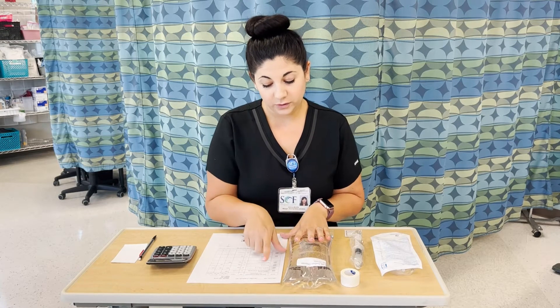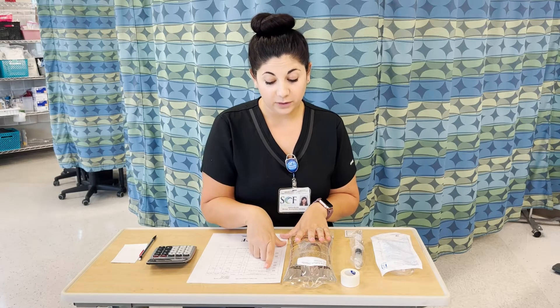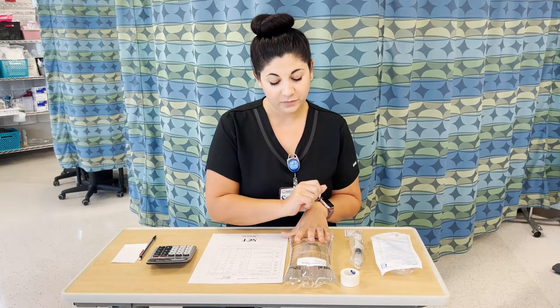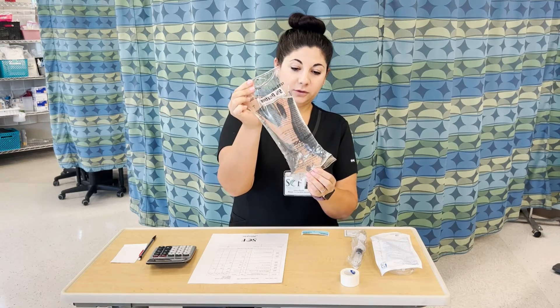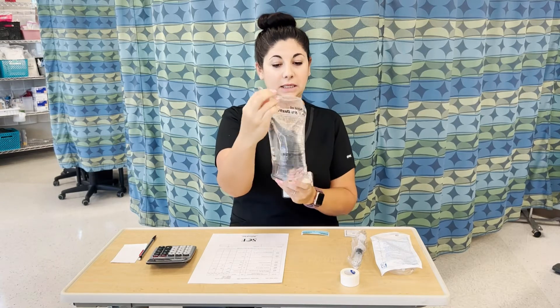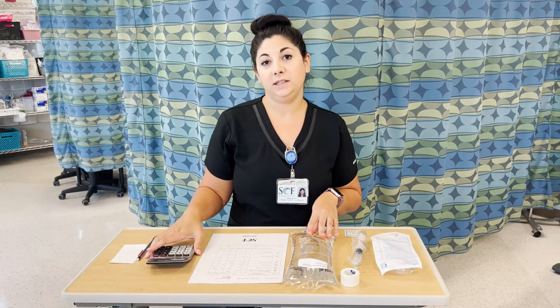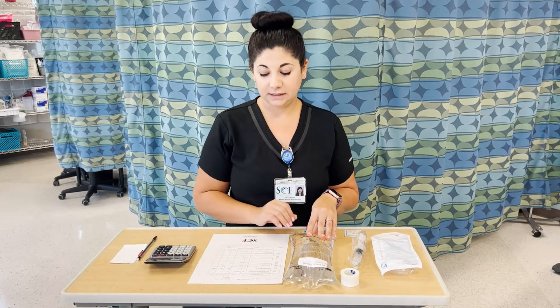I'm going to compare my MAR against my medication, ensuring that I have the right one. I have 0.9% sodium chloride here — checking the expiration date. I'm looking at the fluid to make sure that it is clear, it is not discolored, there's nothing in it, and the bag is intact. I've done my calculations, and I know that I have a 20 drip per minute drip rate, so that will give me 5 drips in 15 seconds.